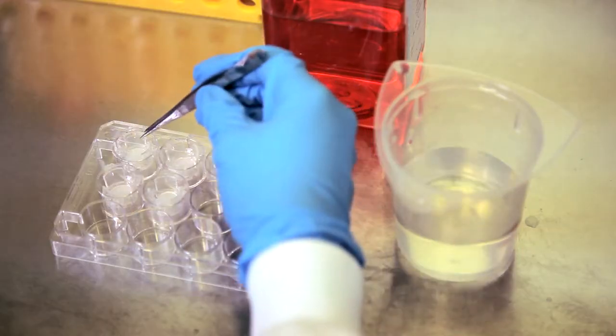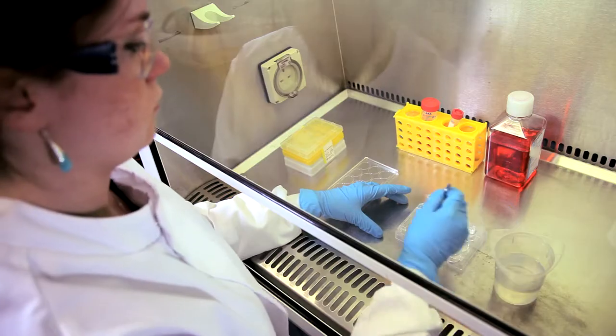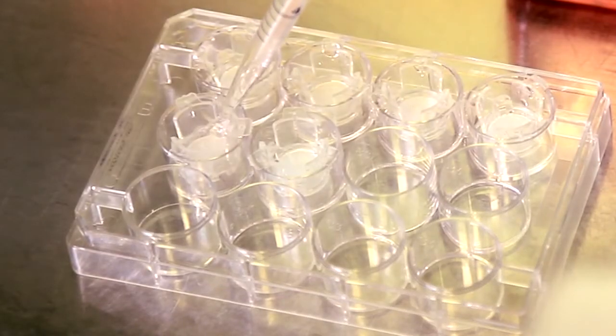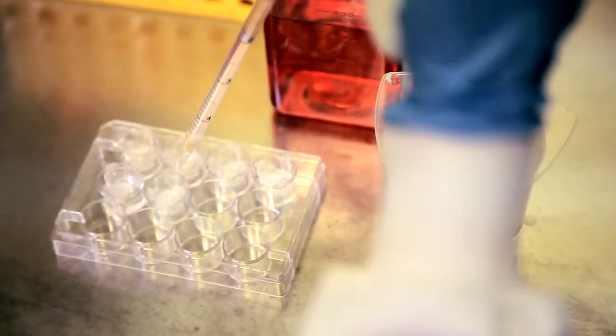You can pre-treat well inserts by dipping them into a beaker containing ethanol before placing them in the chosen holder vessel. Alternatively, you can treat the well insert with ethanol once it's positioned in the plate. Simply add enough ethanol to the well so that the level of the liquid rises over the Alvatex membrane.